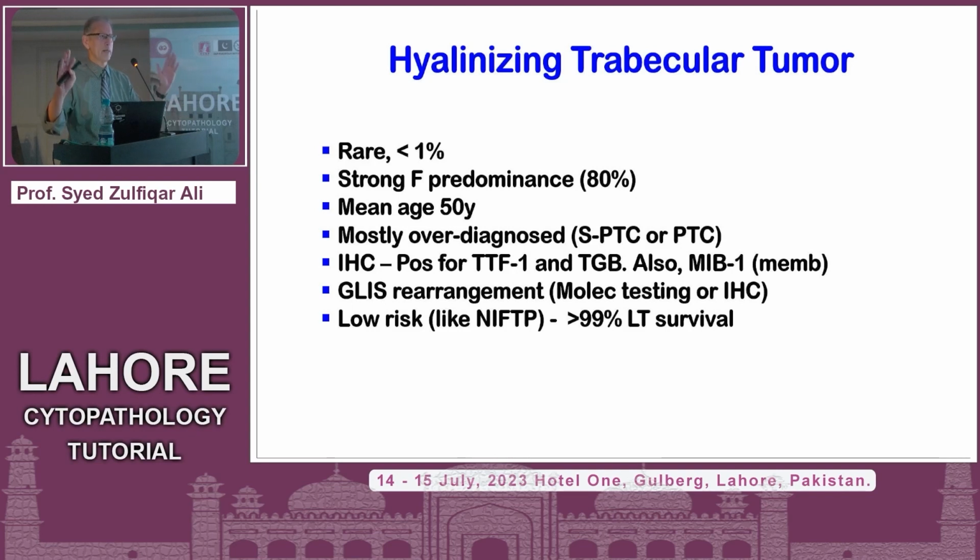So all of you who said malignant are partially right because it can behave aggressively rarely, but it's typically considered a benign tumor. Which Bethesda category would I use? That's the question. I think I would call it follicular neoplasm with a note that differential diagnosis includes a hyalinizing trabecular tumor.